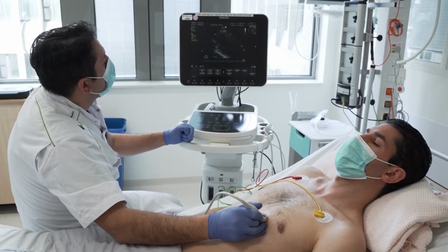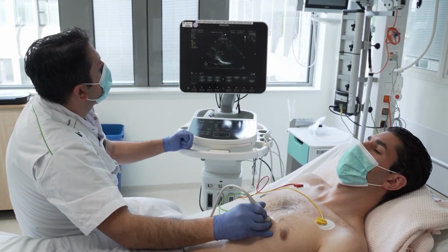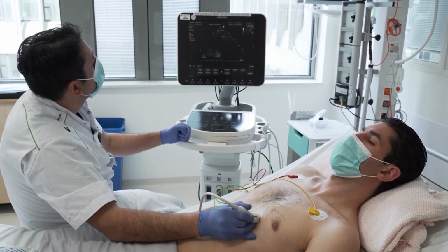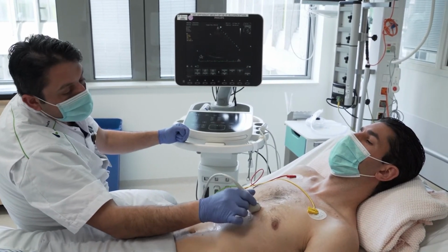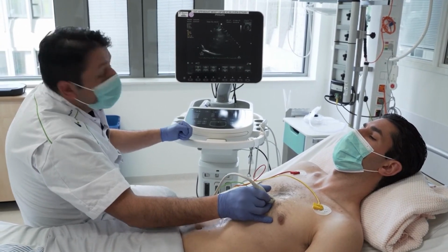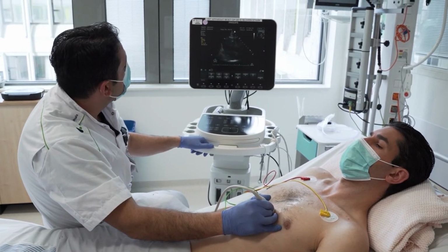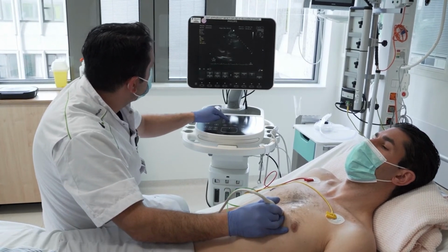And again, here we look at left ventricle and right ventricle dimensions. If you have very high right ventricle pressures, you will see a flattening of the septum. We call this the D sign. And eventually, if you tilt a little bit more, you can see the short axis aortic valve view. In backside laying it is always difficult to get the best short axis view, but we are trying, and you will see here somewhere the aortic valve in the middle.